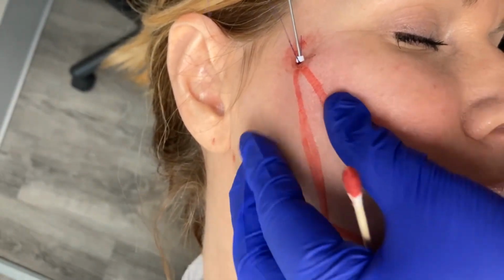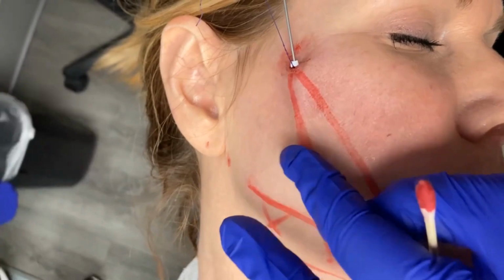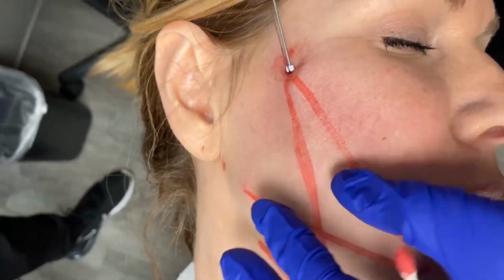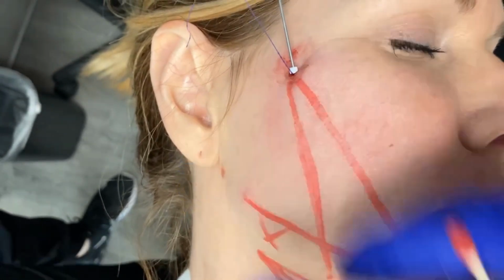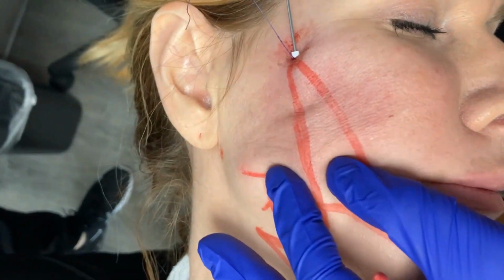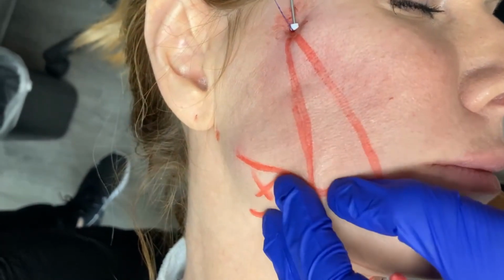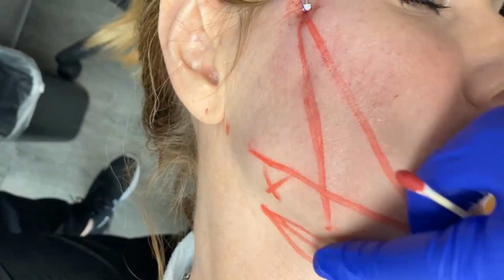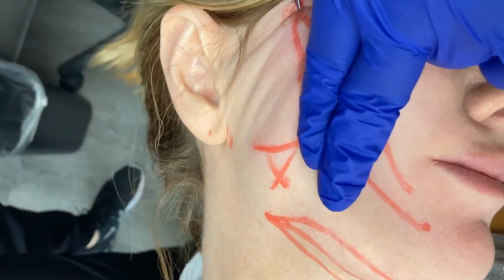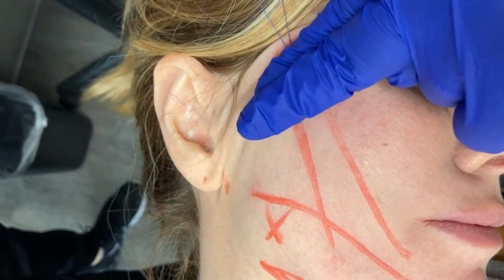Compare this. This is a minimum amount of threads because we're using the strongest V-Soft Lift threads and getting the maximum result, as you are going to see. Go ahead and follow that tunnel. Use your non-dominant hand, curtain over the curtain rod, and you can see that's going to go into place very nicely. Patient is very comfortable, and she's a nurse practitioner, by the way. Exaggerate that lift as you pull everything out, and there you have it.